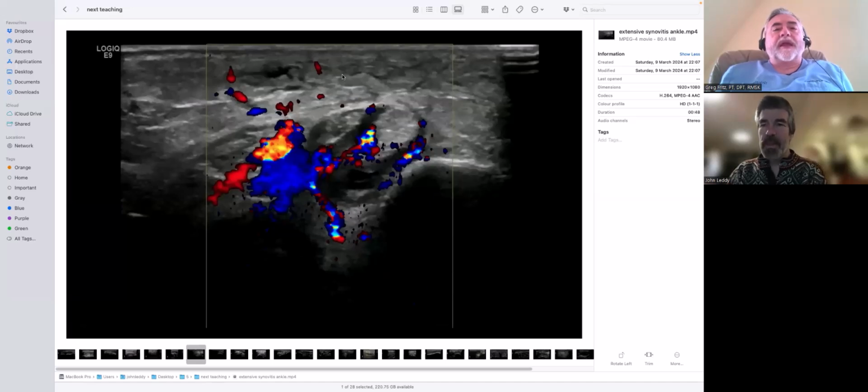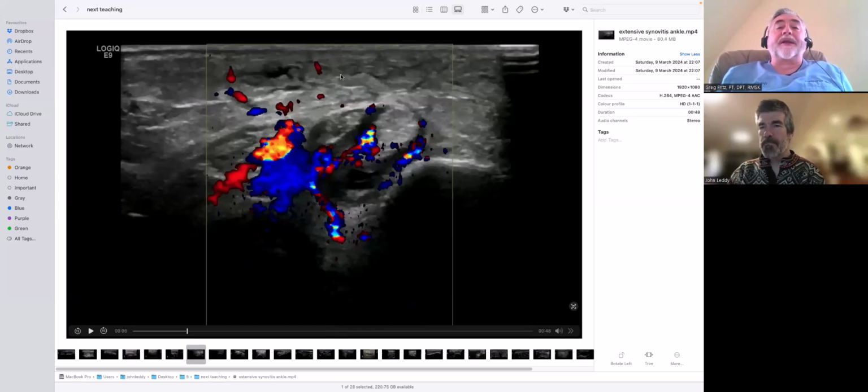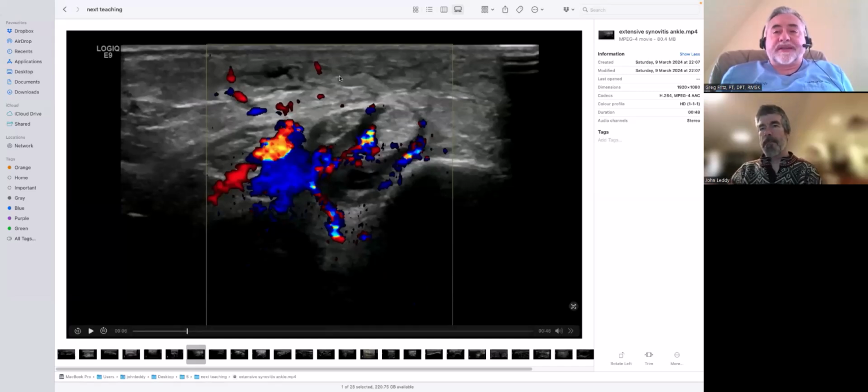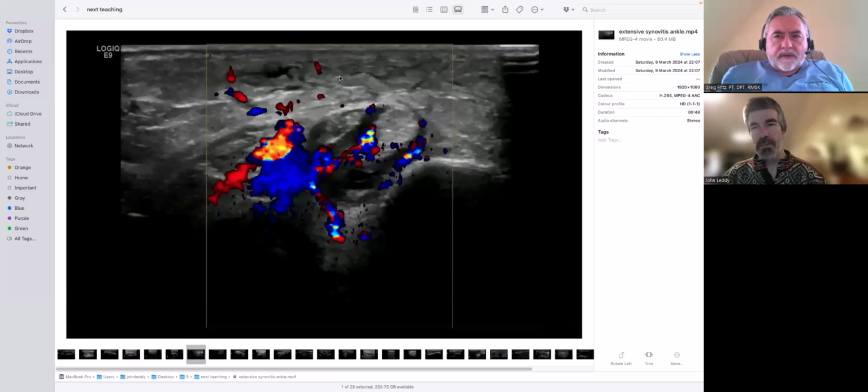Yes. And so when we talk about clinical practice here, are you lightening up your touch at all, or do you scan always as though you're Dopplering? No, not at all. I use a lot of pressure a lot of the time when I'm scanning. But I often use very little, but equally, I press very hard.